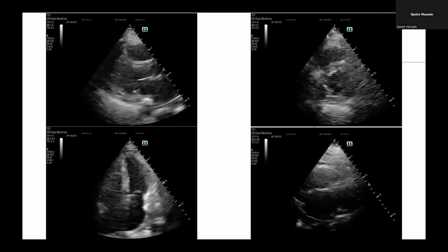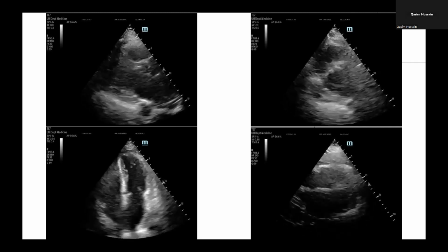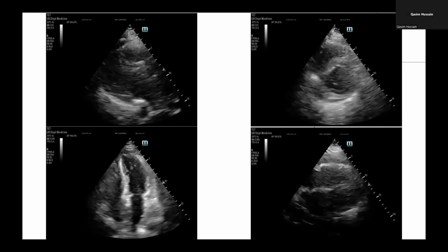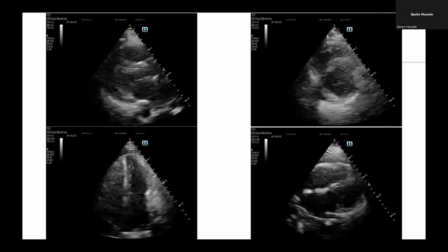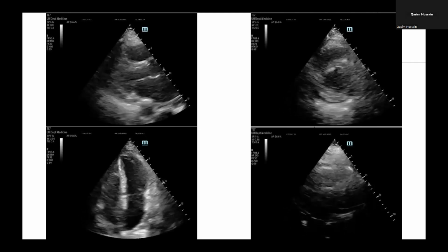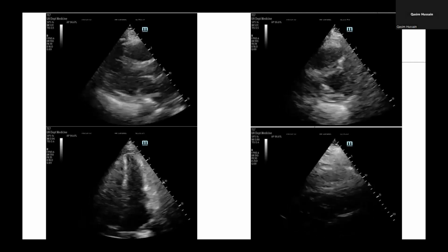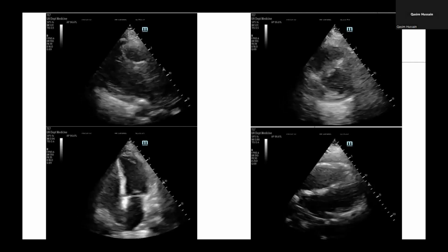But of note, the systolic function looks pretty good on all of these views. So at this point, maybe a month or last year for sure, I may have considered giving this patient fluids. They came in febrile. They have underlying ILD. Sure, their hemodynamics weren't compromised in any way, but given that she could have been screaming a septic picture, I'm like, oh, maybe 500 cc's to a liter of fluids, this patient would have been able to tolerate quite nicely, or that may have been how I treated her a while back.